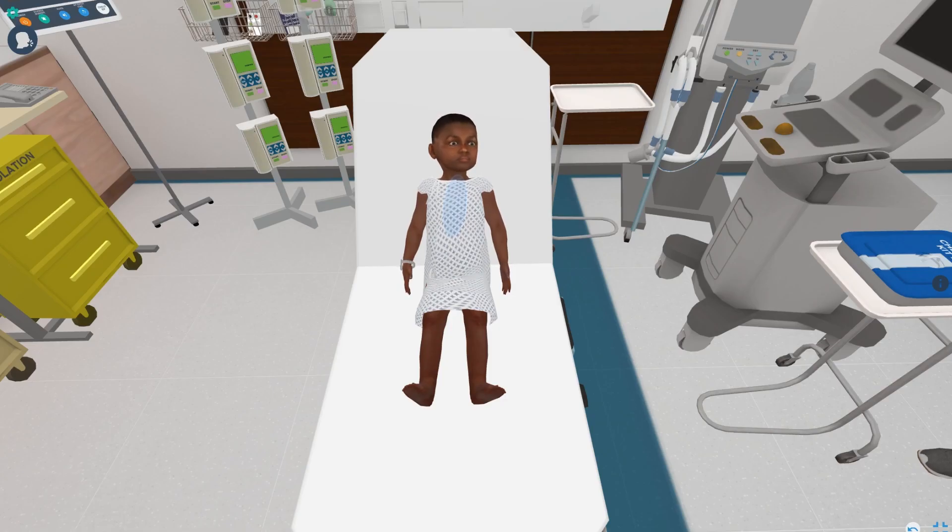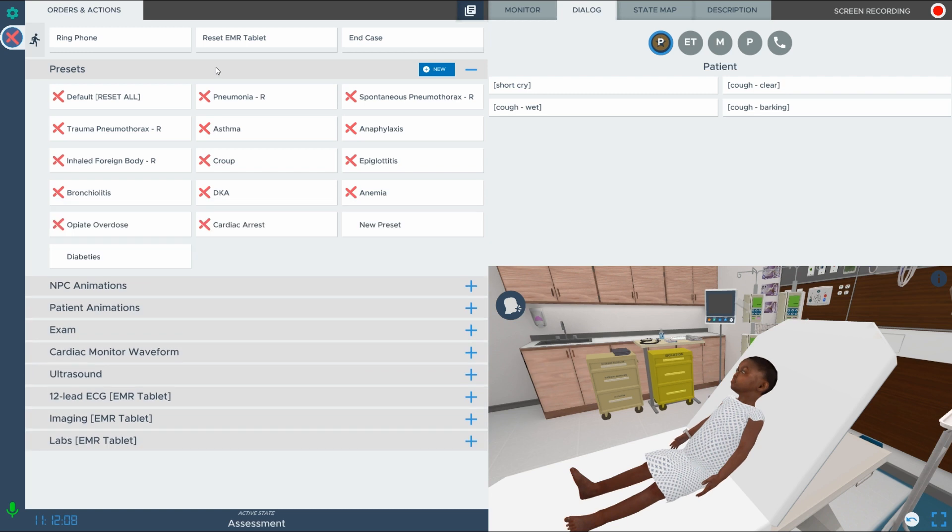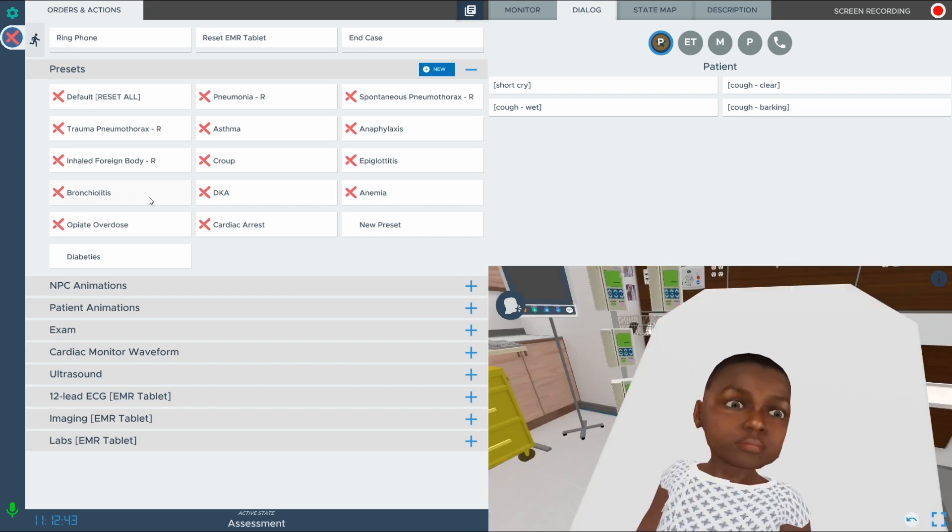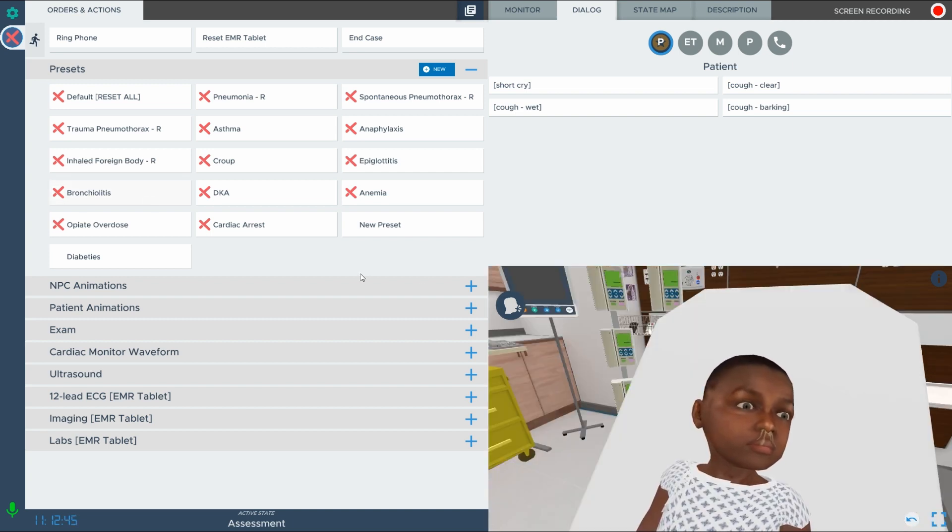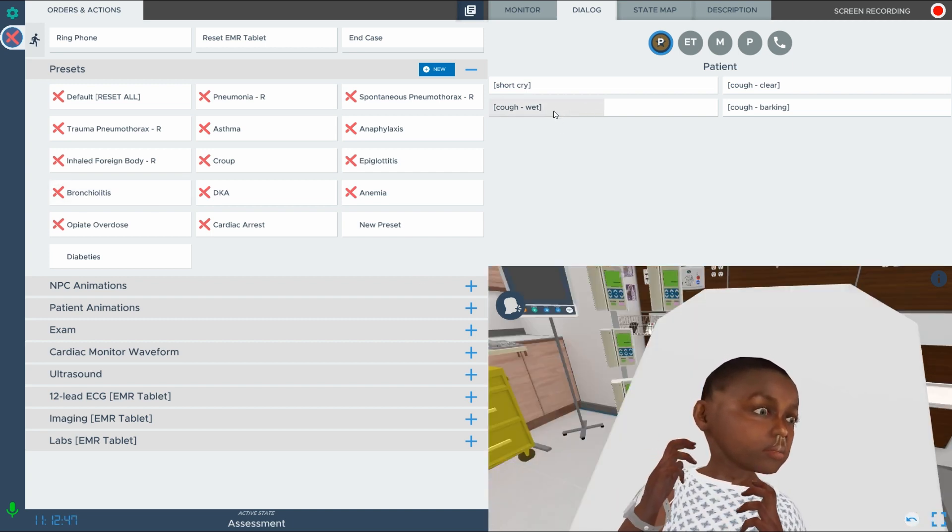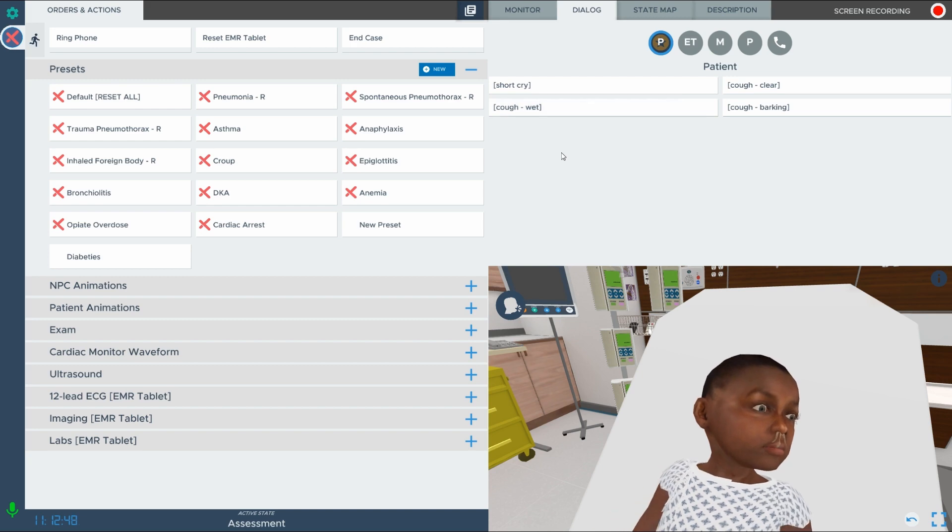With the SimX Virtual Mannequin, you can take advantage of programmed presets. At any time you can make available to your learner a variety of lab results, imaging, and exam findings that support the preset diagnosis. Once you have selected a diagnosis, watch as the patient exhibits preset signs and symptoms.